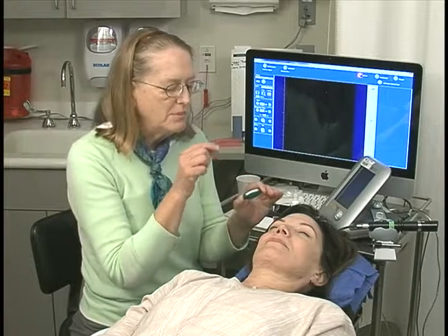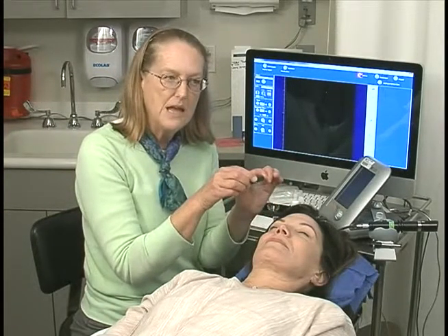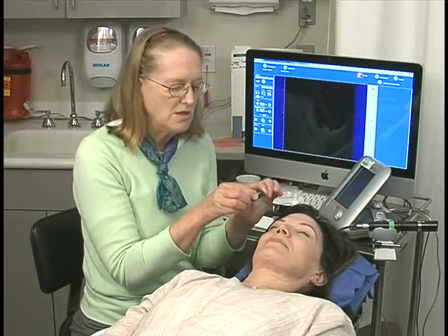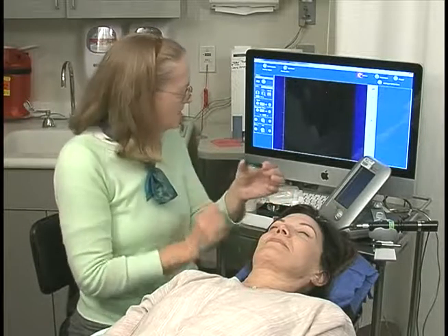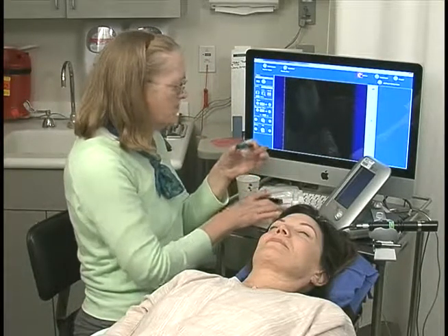I will be placing the probe directly over the actual tissue I need to image in the UBM. There are different ways of performing UBM.